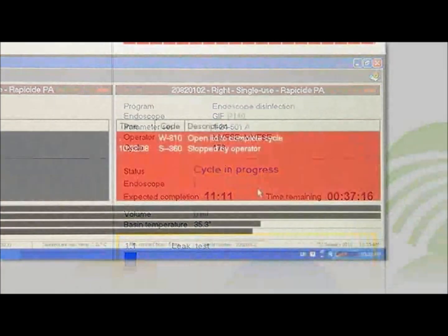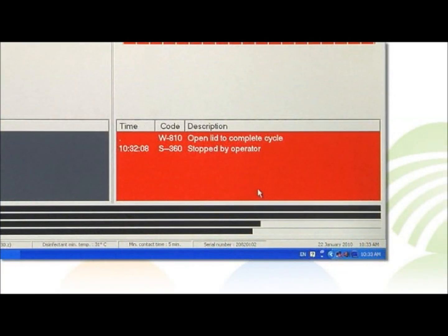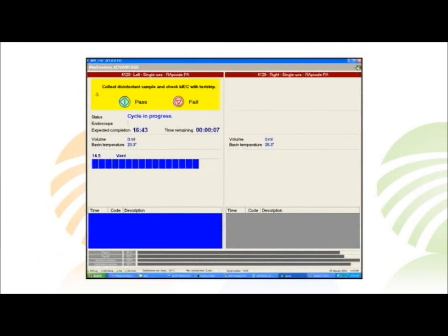Program messages including error messages will be indicated in the box noting the time, error code, and description. When the disinfection process is complete, the program screen will prompt the operator to test the high-level disinfectant MEC with a test strip.